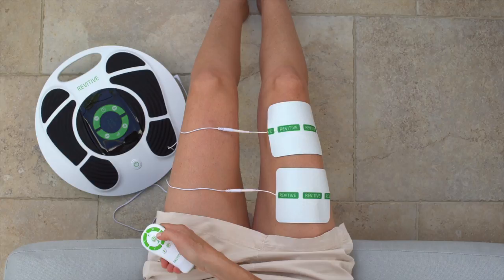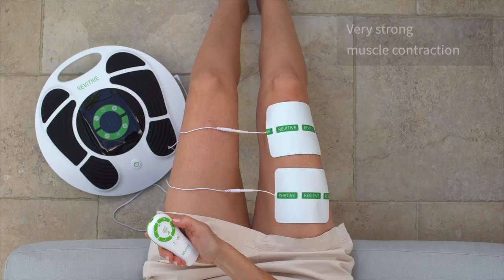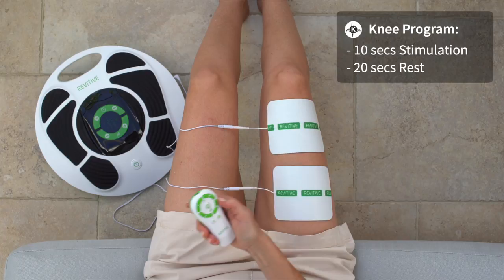The intensity level goes from 1 up to 99, and you want to find your highest tolerable intensity level where you get a very strong muscle contraction. For the remainder of the 20-minute session, you will feel 10 seconds of stimulation followed by a 20-second rest period, which repeats. It's not possible to adjust the intensity during the rest period.